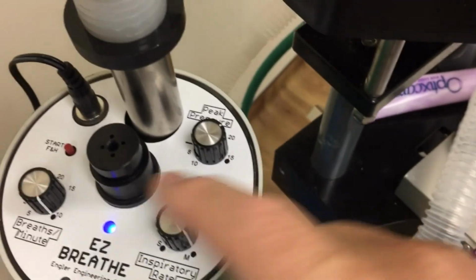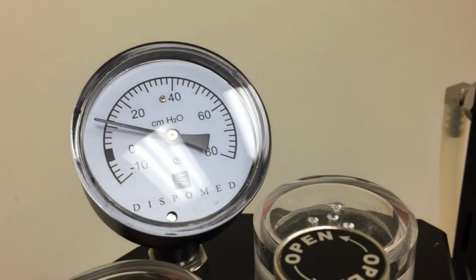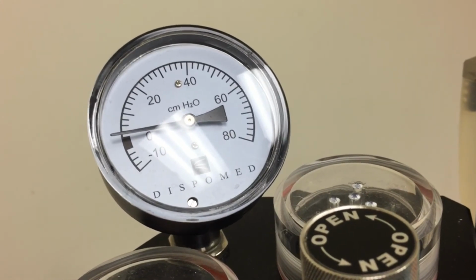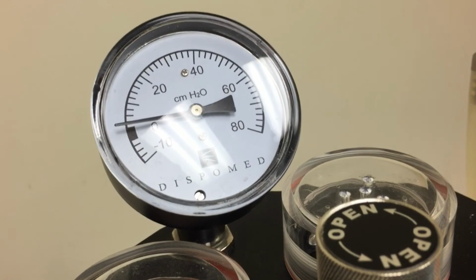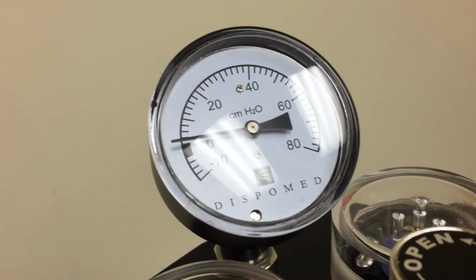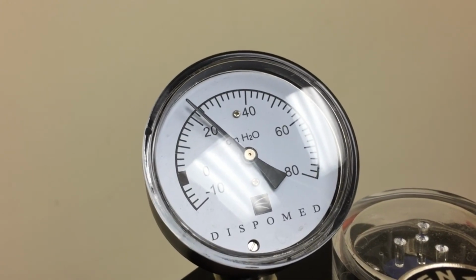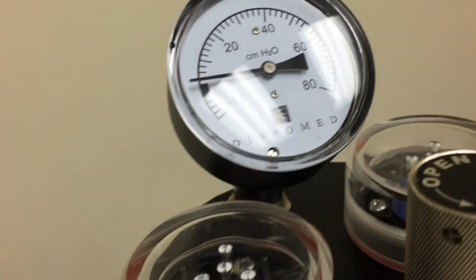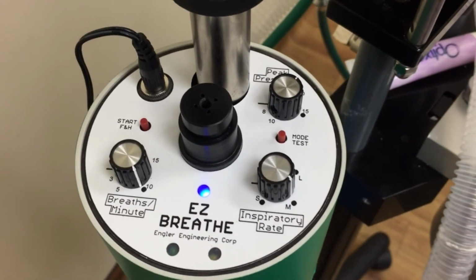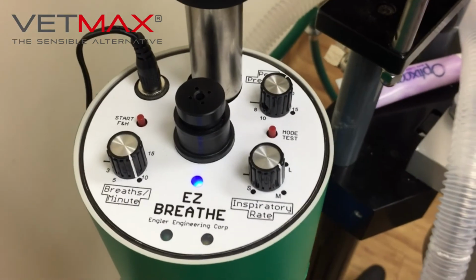You will also sometimes hear it in test mode. In test mode, if the pressure from the incoming flow meter gets too high, Easy Breathe will cut out and you will hear the alarm. When you release the button, the pressure will come down and the alarm will turn off. Again, we hear the overpressure alarm. In most cases, the overpressure alarm is just temporary. I can also get that if I squeeze the bag. As soon as the pressure comes down to normal, it stops.